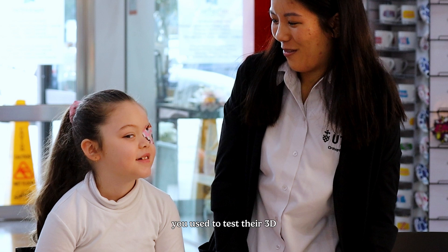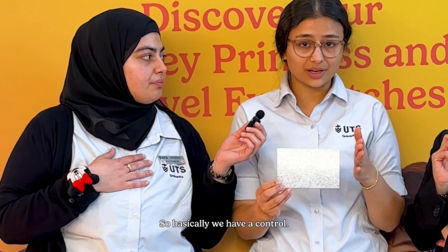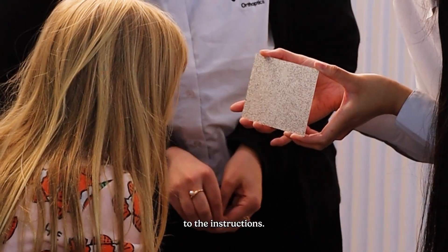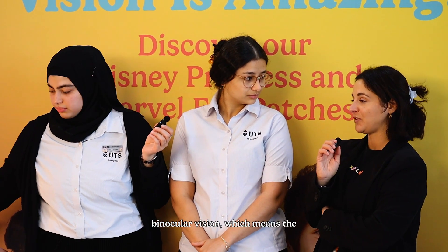And what were some of the tests used to test their 3D depth perception — like how well they can see with both eyes equally? So we've got the Lang test. Basically we have a control, which would be the star — everyone should be able to see it, just testing whether the child is paying attention to the instructions. Then we've got different disparities, which tests the level of binocularity they have. And if they don't have binocular vision, which means the two eyes working together, does that mean they're more likely to have amblyopia? Yes, exactly.